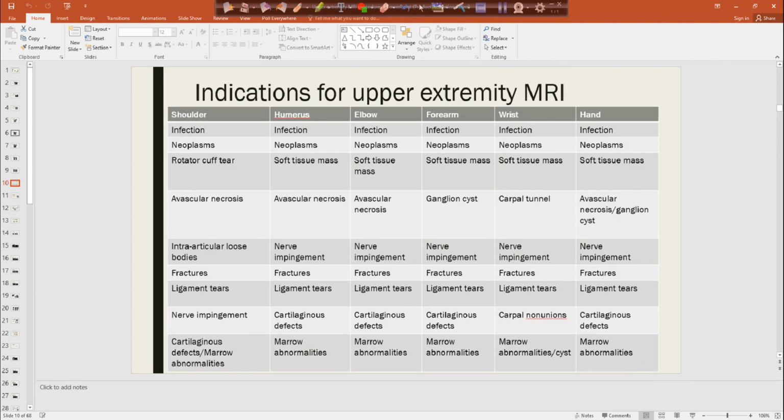All right, so indications for our upper extremity. Most of the time, are you going to be giving contrast with MSK imaging? Perhaps. Sometimes. For shoulder. But is that arthrogram contrast? I'm talking about gadolinium. If they suspect a tumor or infection, but other than that, okay, fine.